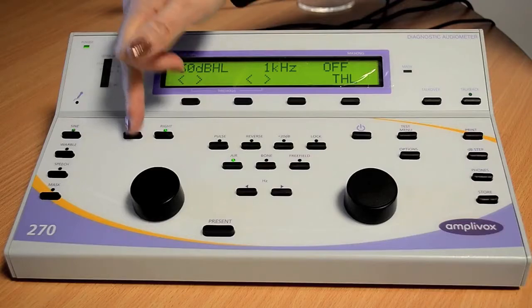When you turn the audiometer on, it will be set to the left ear. To change the ear to the right ear, press the right button. If you want to change it back to the left ear, press the left button.